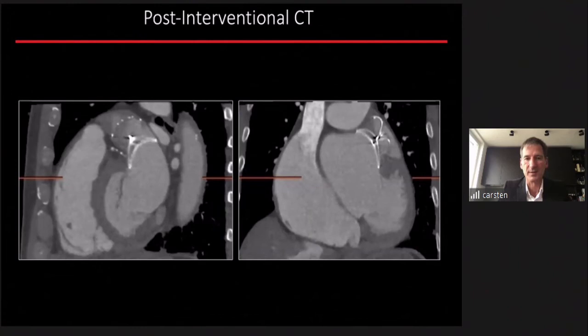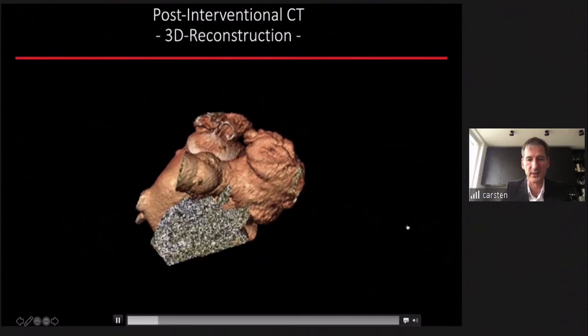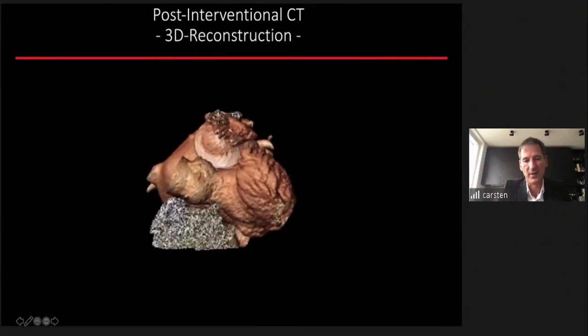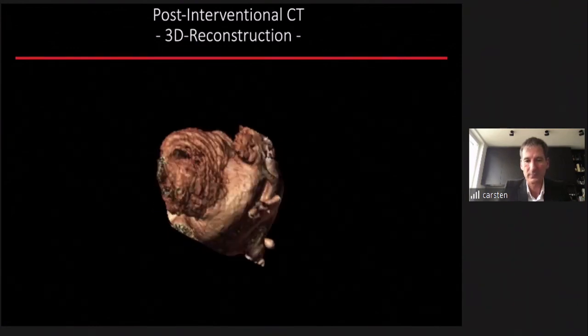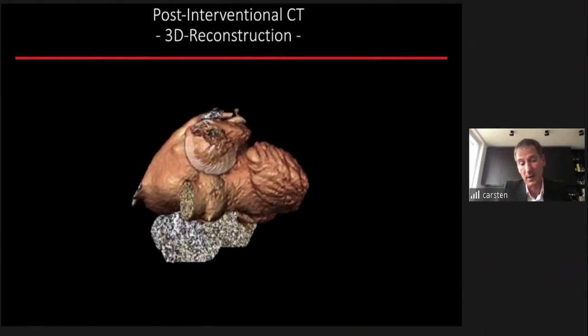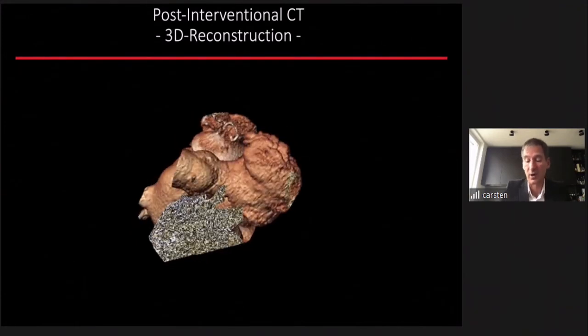So this is the post-interventional CT confirming the TEE imaging. So, complete sealing of the LAA. And here is the 3D view where you can really nicely appreciate the device within the LAA. So imaging plays a larger and larger role and makes you just more confident about what you are doing.